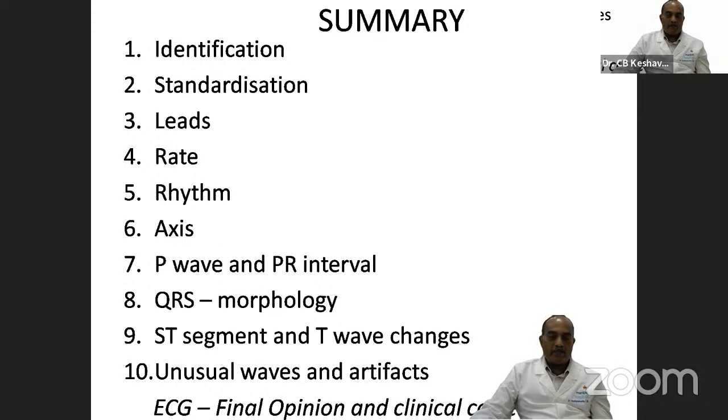So ECG is not just about the theory of going through classes and hearing it. ECG is learned by seeing ECGs. If you can see serially 1,000 ECGs, you will master the art of reading ECGs. So as soon as there is an ECG, show some curiosity, show some interest, it may be normal. Just pick up the ECG and read it according to these 10 points.